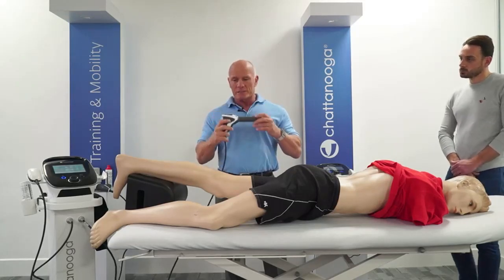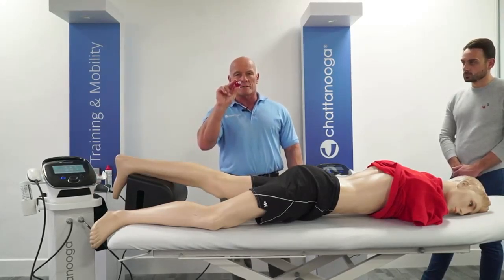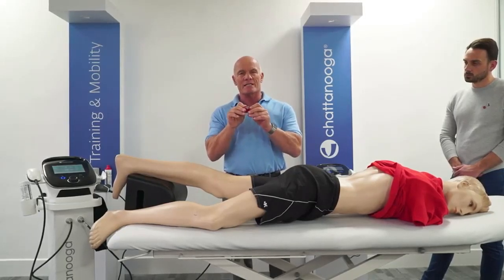With a standard transmitter, for a tendon like this, the RO40 will produce 0.38 millijoules per millimetre squared, and those are the units we use to measure the energy.